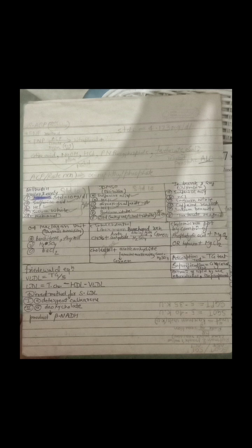Now the Jendrassik and Grof method for bilirubin, the reagents are sulfanilic acid, hydrochloric acid, sodium nitrite, and a point to be noted, the other reagent, that is caffeine reagent, sodium benzoate and tartrate reagent. That's all about the bilirubin test.